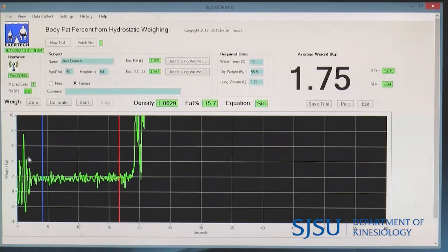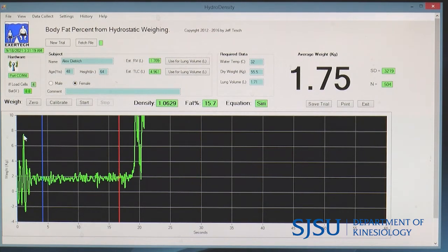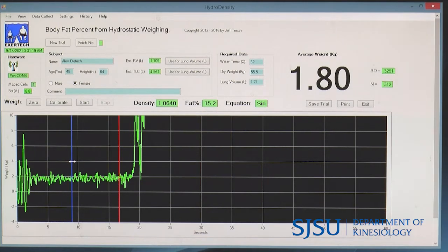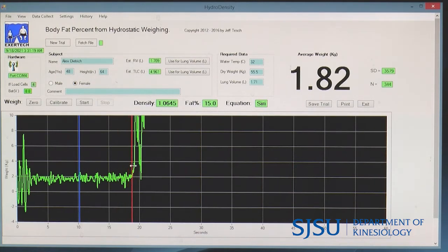The y-axis shows her weight in kilograms and the x-axis shows time in seconds. The large green vertical line represents when her head is out of the water — she weighs more then because we don't have that buoyancy effect. We move the bar to where she is fully submerged, and shift the red line to where she has popped back out. Her average underwater weight between the red and blue lines is 1.75 kilograms. Moving these bars changes her underwater weight, density, and body fat percentage.